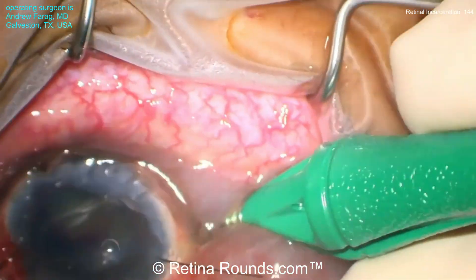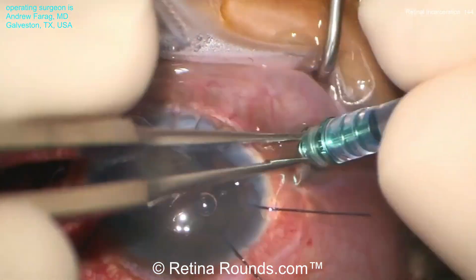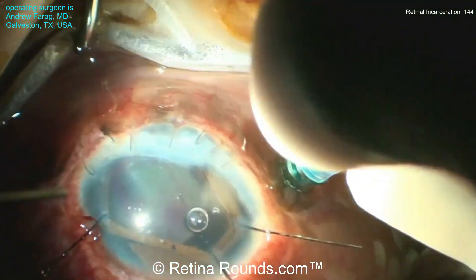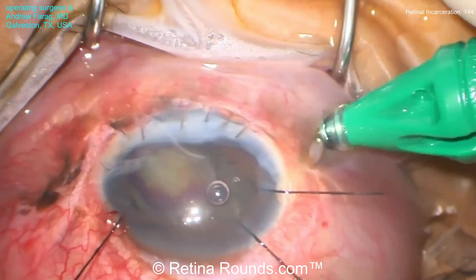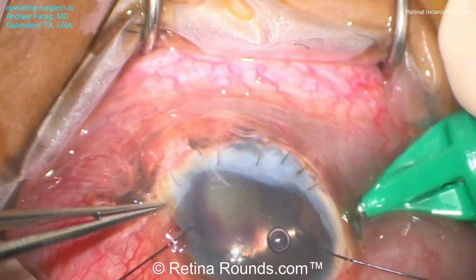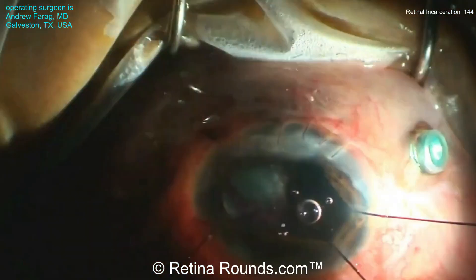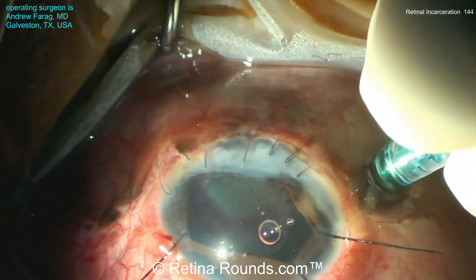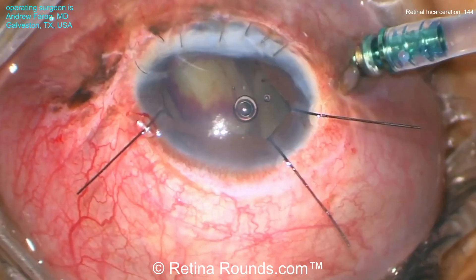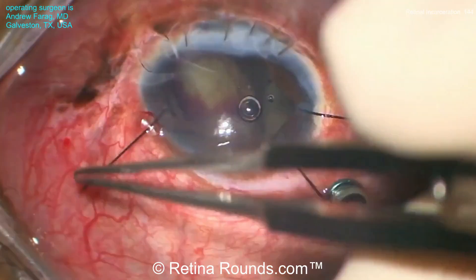Some trocars are being placed for a three-port pars plana vitrectomy. Dr. Farag is going to use the cutter to remove the crystalline lens. He's checking to see the tip of the infusion cannula — not seeing it — so he's pushing the trocar in more snugly so it's flush with the scleral surface. He's placing his infusion line and checking to make sure it's in the vitreous cavity, an important step to avoid infusing into the suprachoroidal or subretinal space.